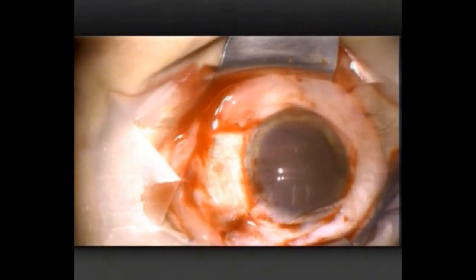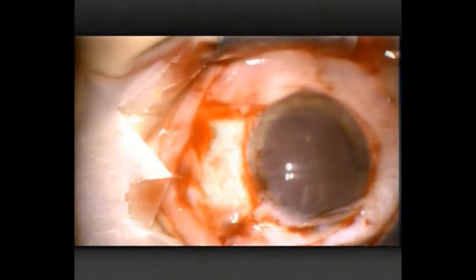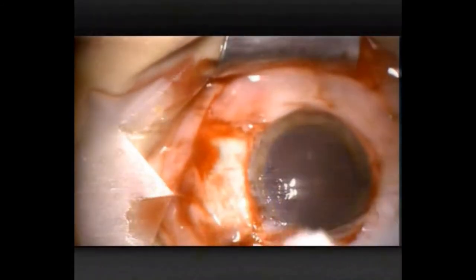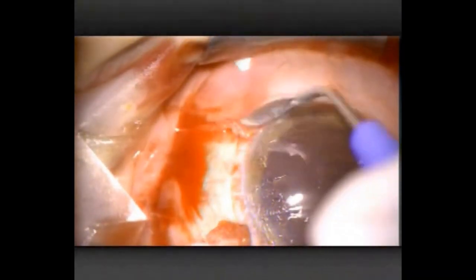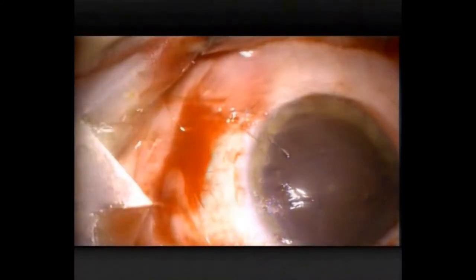This surgery is nearly finished. The final thing I do is cut the stay suture and then go back to the bed underneath the head of the pterygium. The residual scar tissue will have absorbed some fluid and swollen a little bit, and it's actually easier to scrape it off at this stage. I'm trying to leave the smoothest bed I can possibly leave without any elevations, because anything that's elevated or residual scar tissue will tend to stimulate inflammation, which leads to regrowth. So I like to have that nice and smooth.